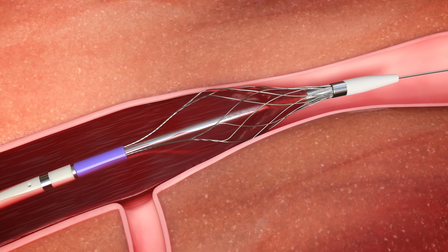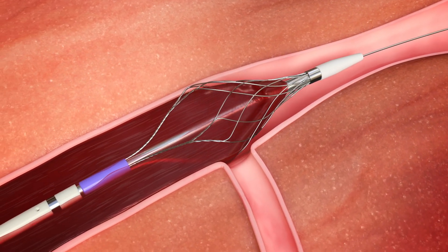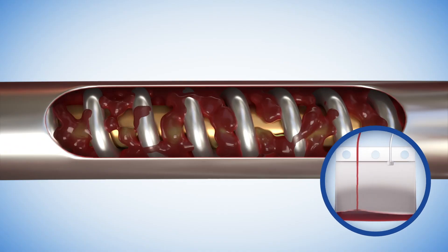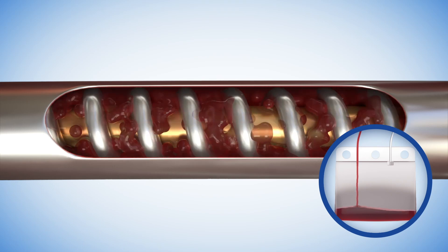The basket funnels the collected clot toward the center of the lumen for extraction. This continuous feeding forces the clot into the window, where it engages the extraction screw, which macerates and transports the clot into a collection bag outside the body.